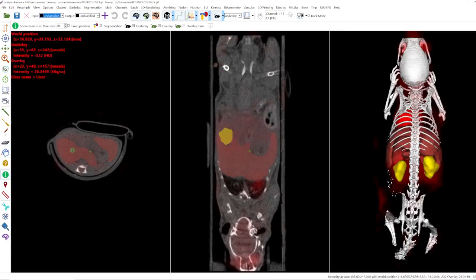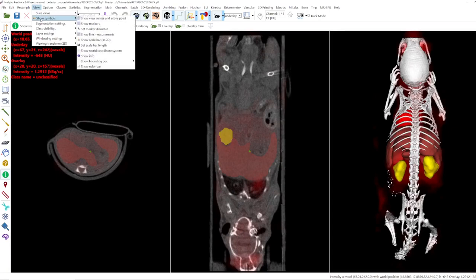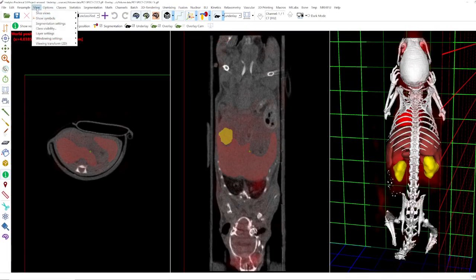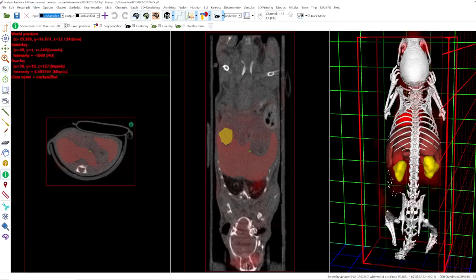It shows the world position, but also the position of the underlay and the overlay, and the coordinate system. To explain this a little better, let me show the world coordinate system. You can find it under View > Show Symbols > Show World Coordinate System. We also have a bounding box for the underlay under Show Symbols > Show Bounding Box > Underlay Bounding Box, shown here in red.